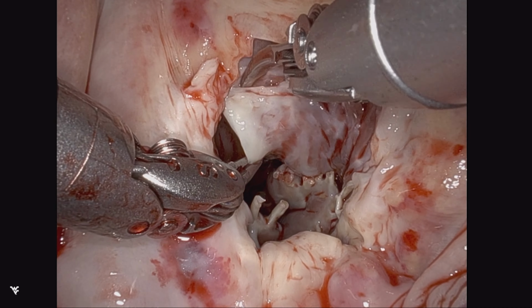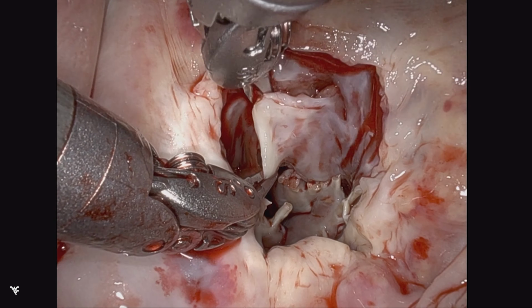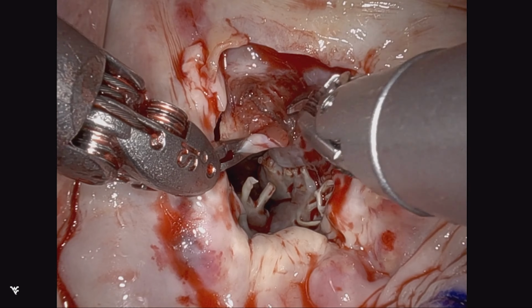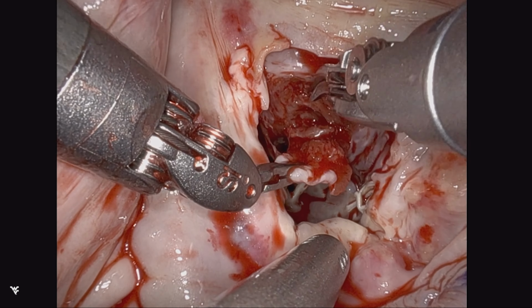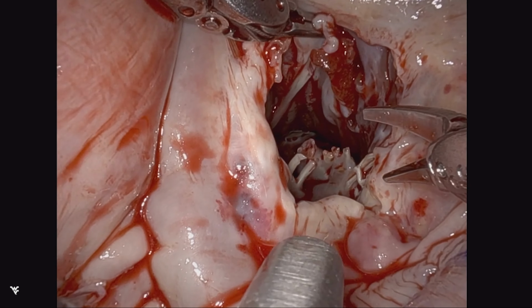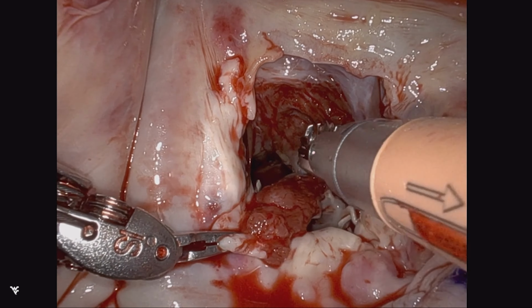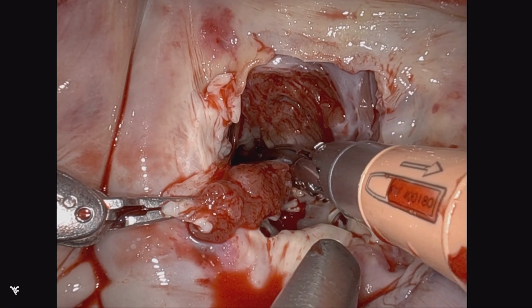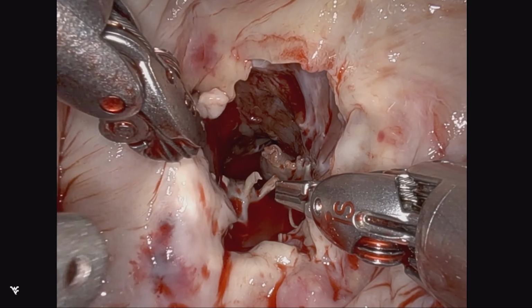So this is the debulking of this septum using sharp dissection, transmitral. And you can see you can get easily down into the ventricle below the papillary muscle base to get a good intraventricular resection, to then relieve this outflow tract obstruction.